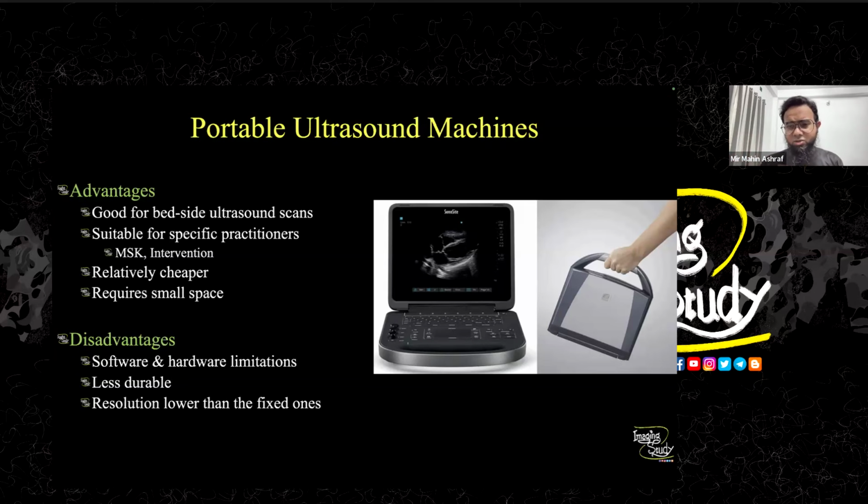These machines get slower by time usually. You know, this is 2024, and the manufacturers are making very beautiful, very expensive ultrasound machines. Like if you see my mobile phone, it has got, I think, 12 gigabytes of RAM. Usually nowadays, gigabytes of RAM for the gaming phones.